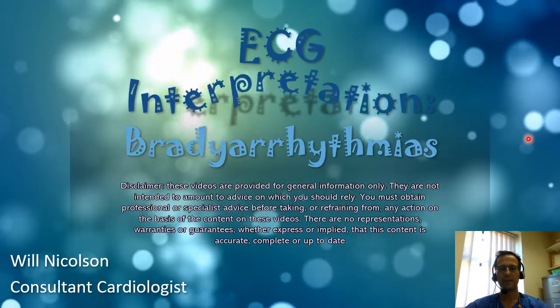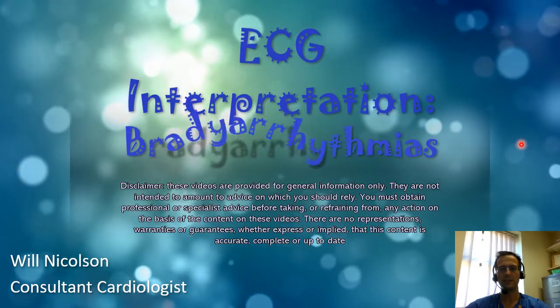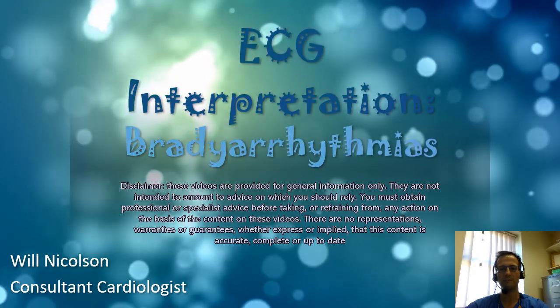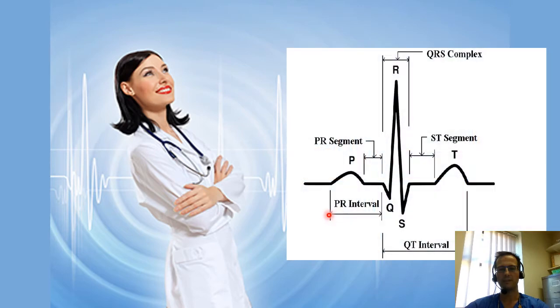Thanks for joining me. I'm going to spend the next half an hour or so talking about ECG interpretation with a particular emphasis on ECGs that convey a risk of bradyarrhythmia. Hopefully in that time you'll move from a state of furious anger and frustration when faced with an ECG screwed up in your fist to a state of Zen-like transcendence where an ECG is very much your friend. I'm assuming some basic knowledge about the ECG and how to go about interpreting ECGs.